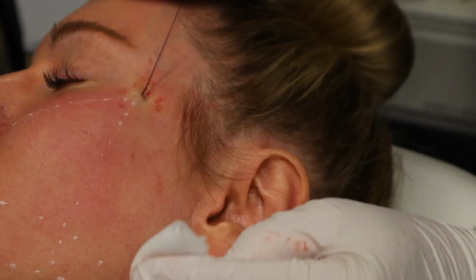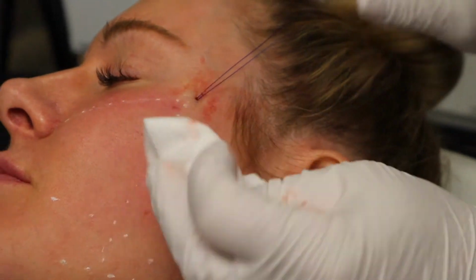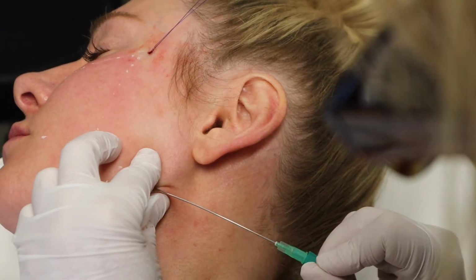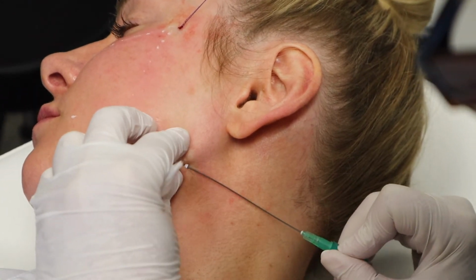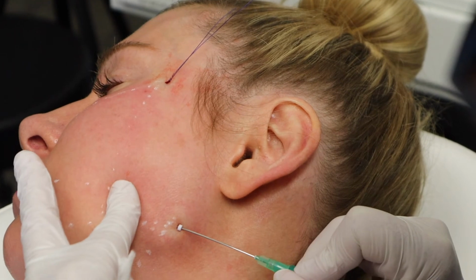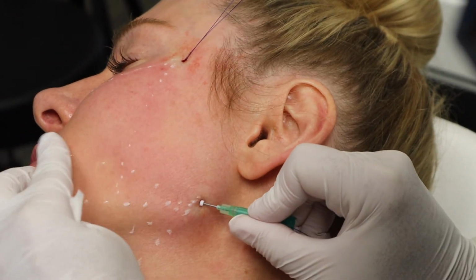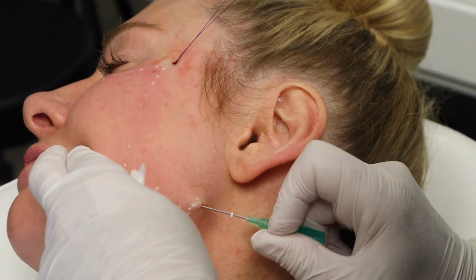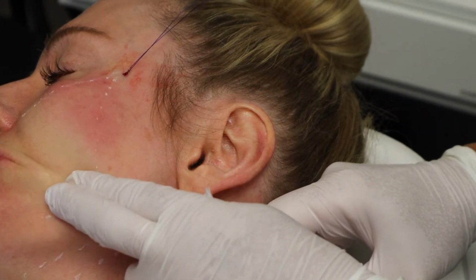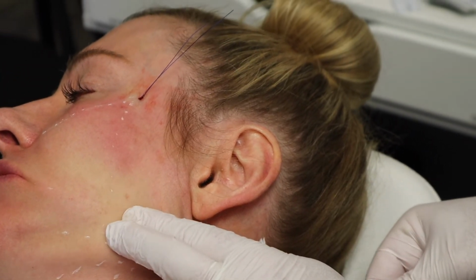Threads can be easily modified while they're being placed. However, after complete placement and snipping, it can be quite difficult to remedy any situation, and especially to completely remove the thread. Here we see a PDO thread being placed toward the corner of the mouth with a nice strong palpation to secure the barbs.